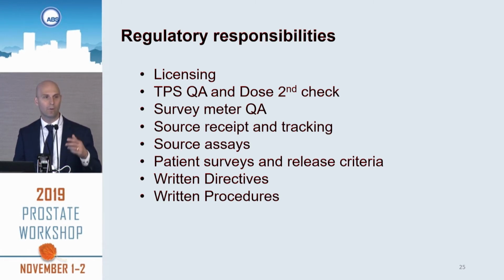And I'm not sure how many people already knew that the NRC requires that you have a copy of written procedures which demonstrate how you will ensure that what's specified in the written directive is actually carried out throughout the implant. And you have to maintain those. So if you're editing these, it helps to have some way of tracking your changes so you can show them what your procedure looked like 3 years ago when you did that implant.